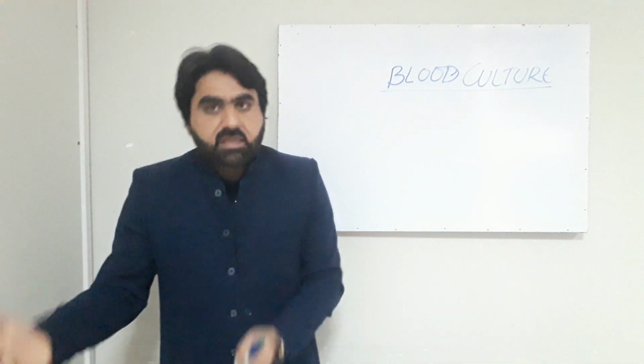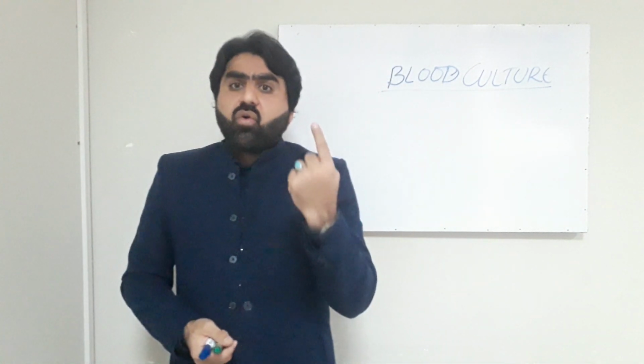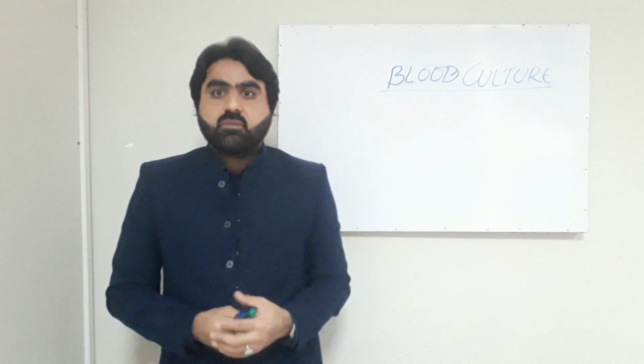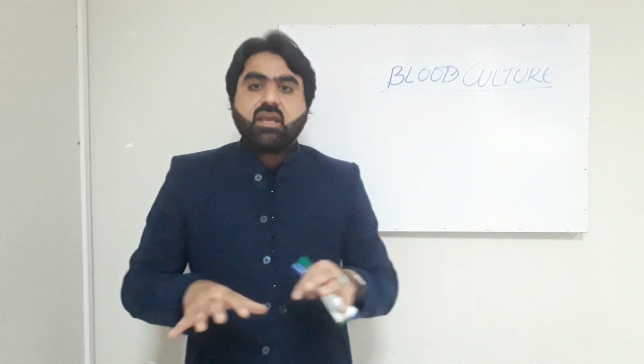We could not opt for the repetition of the blood culture. Same is the case if there is positive growth in only one bottle. Again the recommendation is to repeat, but as I told you, in resource limited settings we are not able to repeat, so we have to interpret the available result.